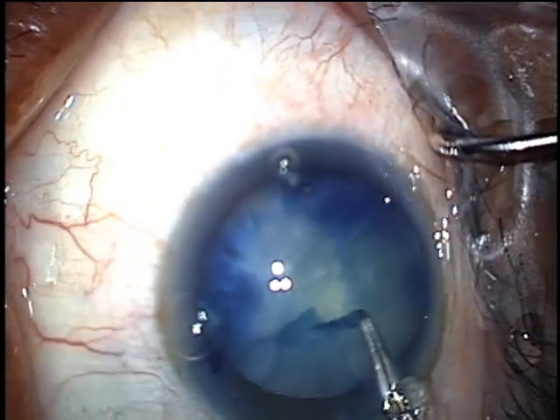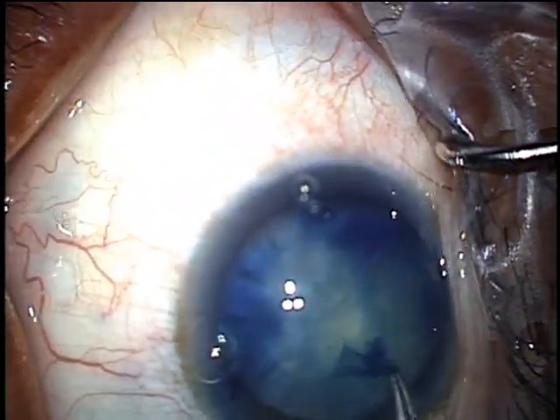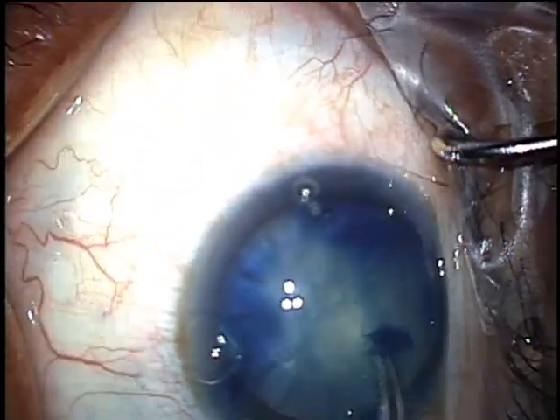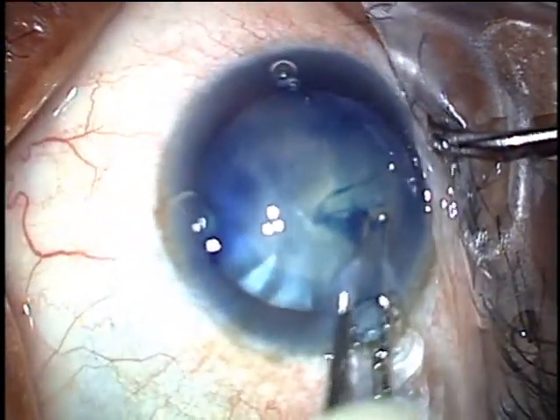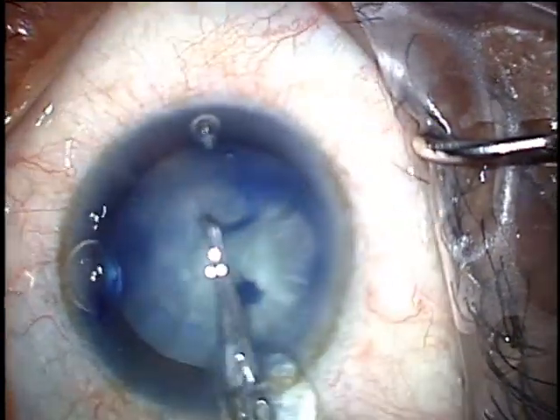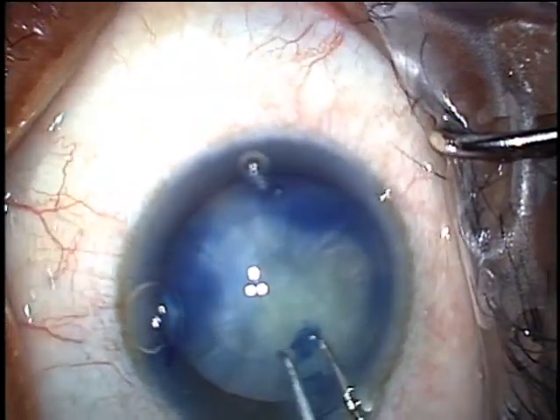Don't forget to add more viscoelastic as you burp it out. I did not do that here. You'll see that the edge of the capsulorrhexis starts going towards the equator — I grab the edge and pull it centrally to save it. But a better technique would have been to stop and place more viscoelastic in the eye.